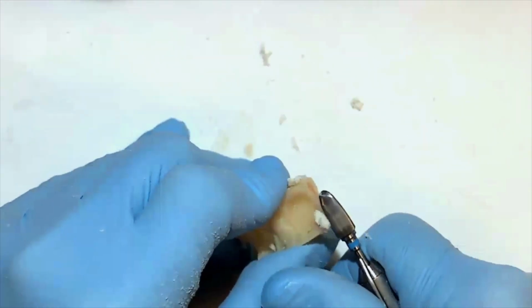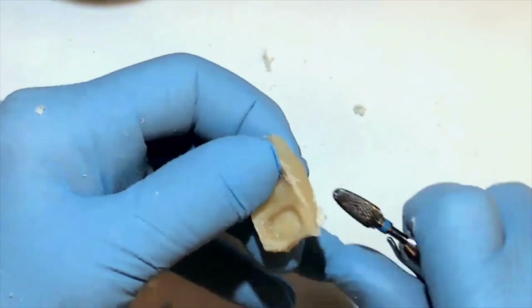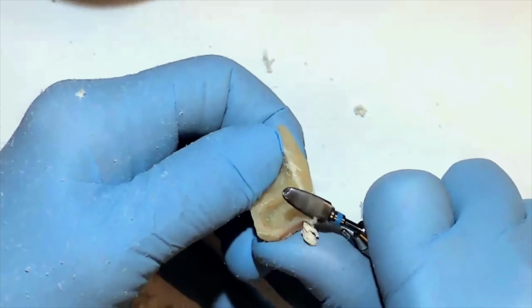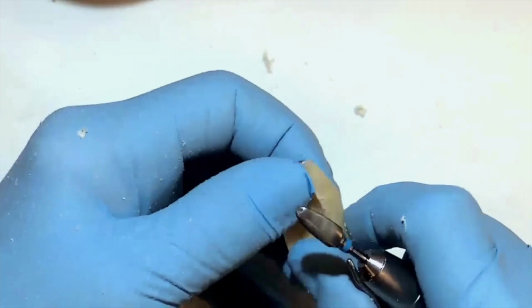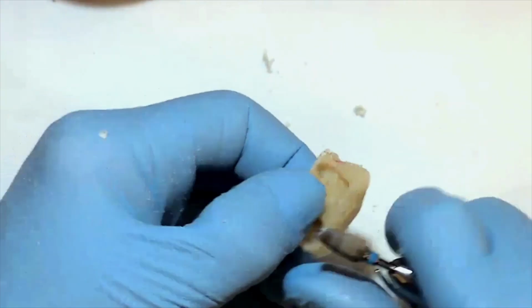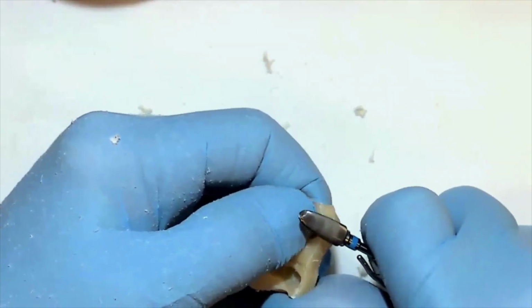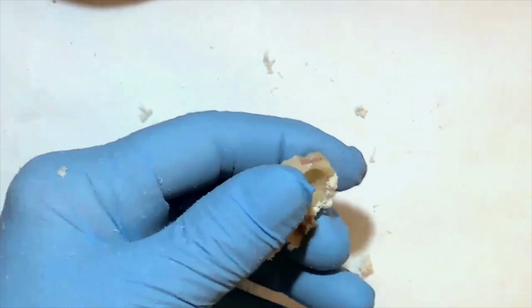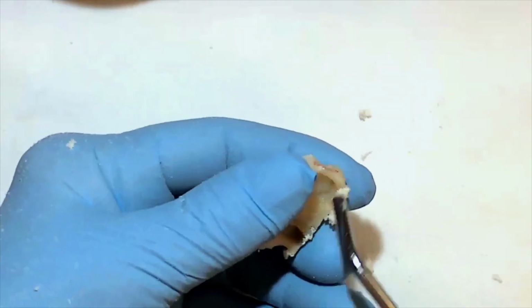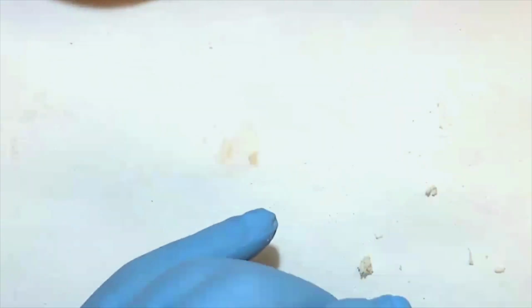When doing this carving, it is important to bring back the anatomy lessons you learned in school in your first and second years to understand the morphology of the teeth, the buccal heights of contour, the palatal heights of contour, the emergence profiles, the proximal embrasure contours. All these things come into play as you carve this tooth back to its proper dimensions within the framework of the bite we did on the articulator.